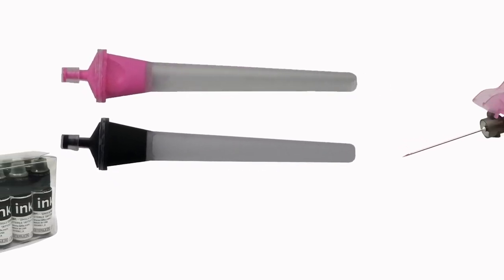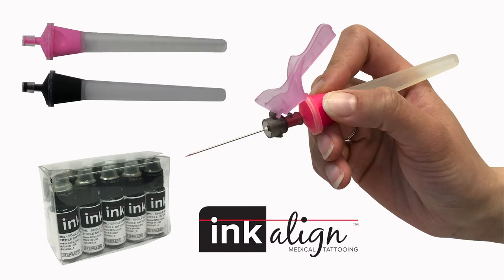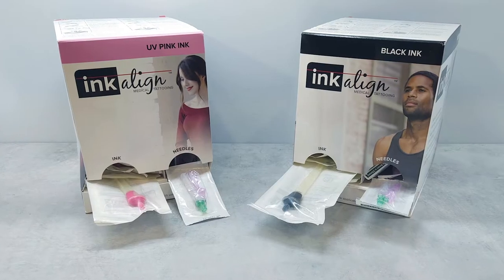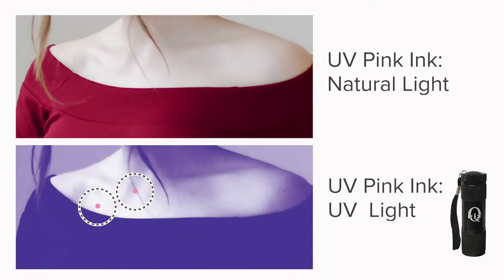QFIX InkAlign is a sterile, single-use applicator that provides a standard administration for radiation therapy tattooing. Available in traditional black as well as UV pink to remove the everyday reminder, as it is only visible under UV light.